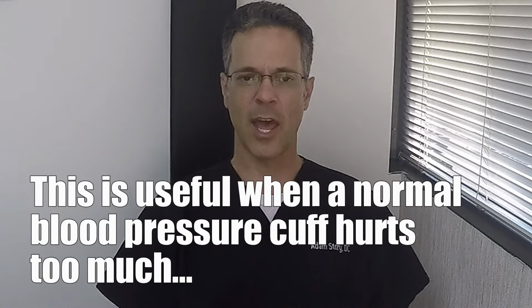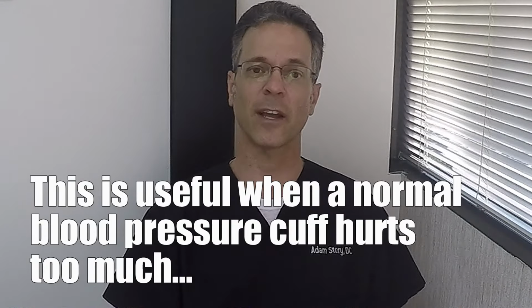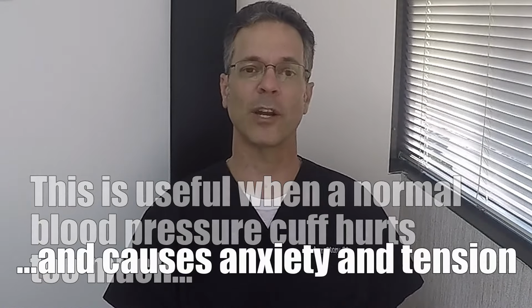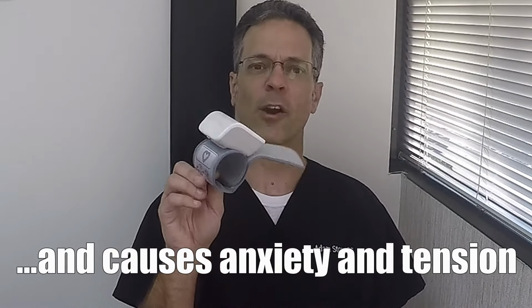Given the choice between a wrist blood pressure machine and a regular automatic blood pressure machine, I would actually choose the automatic blood pressure machine. But these are very, very convenient, and some people find that the normal blood pressure machines actually hurt their arm, or they may have some type of disease that affects their arm and they can't take their blood pressure with a normal blood pressure cuff. So these do come in handy. They are not as accurate.